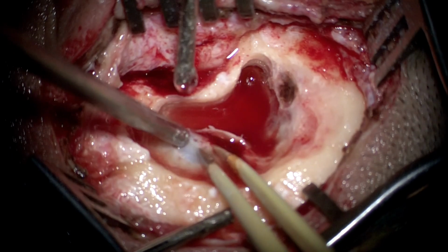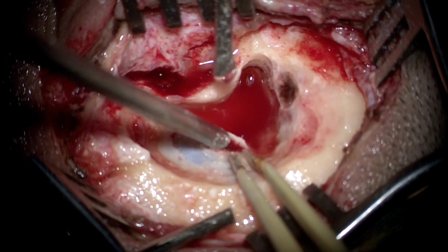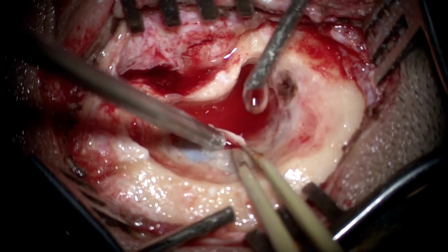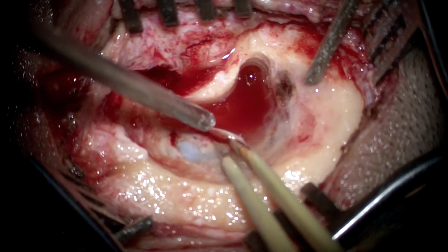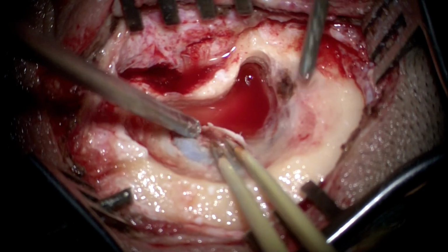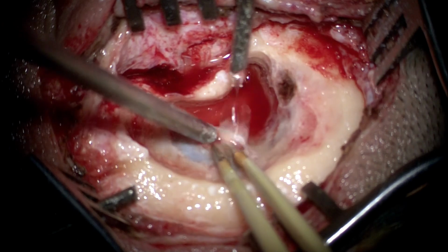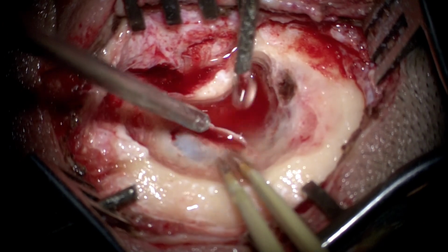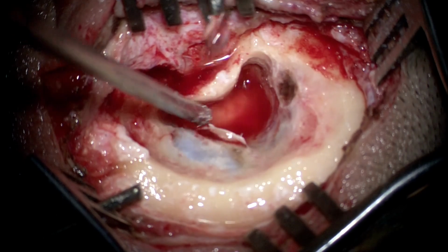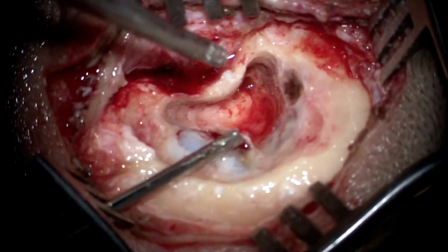Now as you can see here, there is a very superficial and a moving contact over the sigmoid sinus dura from the bipolar forceps on constant irrigation. At no point should pressure be exerted, because the moment the bipolar forceps puncture the dura, we would have hemorrhage, and the whole exercise of decompressing it would be going to waste, because then you would have to use Surgicel or some other hemostatic material to cover the sinus defect.